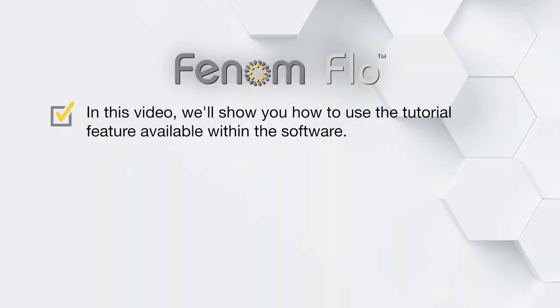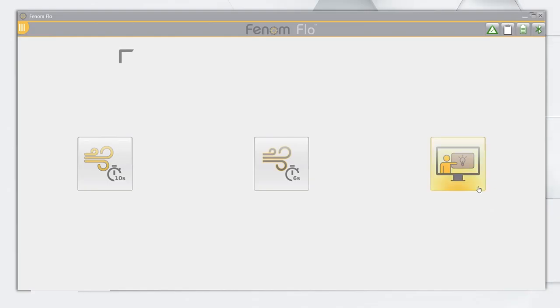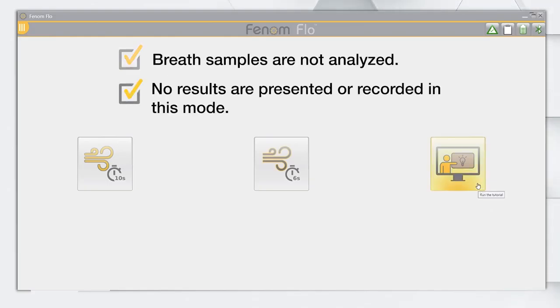In this video, we'll show you how to use the tutorial feature available within the software. The tutorial is available for a new patient to demonstrate the steps for performing a fractional exhaled nitric oxide test with the Fenom Flo device. Breath samples are not analyzed. No results are presented or recorded in this mode.